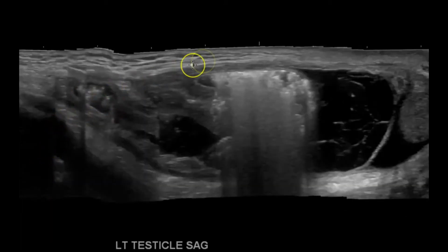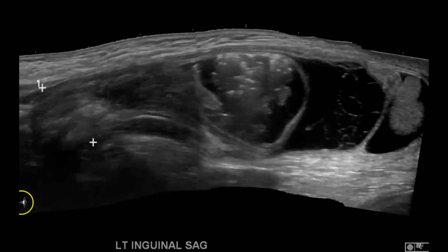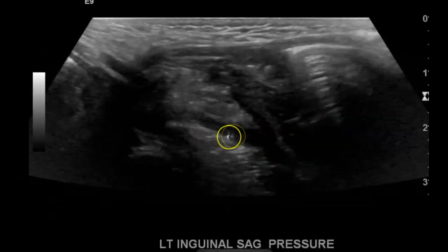Another panoramic still, so very large inguinal scrotal hernia. Here you see bowel with gas in this complex collection here. So here we have where the defect is, or the neck of the hernia. You can see the inferior epigastric vessels here. And another panoramic showing the neck right here, and then this complex fluid collection. Now when this bowel is incarcerated, they are at risk for ischemia and infarction. So this is a surgical emergency. So here's a clip showing the hernia.